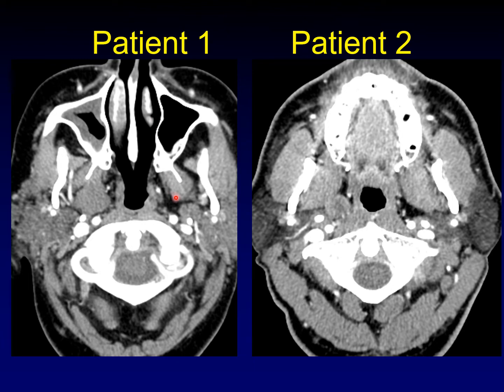Both patient one and patient two have lesions that are replacing the parapharyngeal fat. Here's the normal parapharyngeal fat on the left side, and here is the mass replacing or displacing it on the right. This one is a little more directly pre-styloid; this one is a little more medial. That is not a big difference in the way it is displacing the parapharyngeal fat.